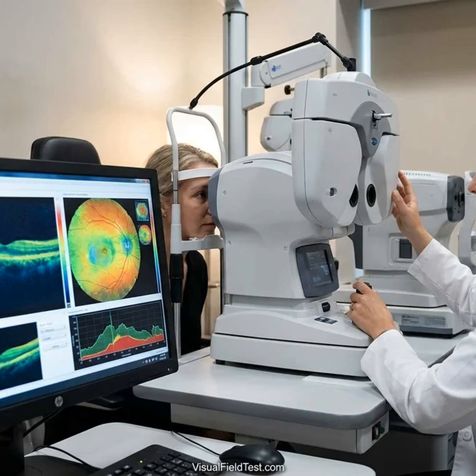In practice, the scan schedule is personalized. Many clinics bundle OCTs with regular visits so that patients get an OCT at each checkup. The key is consistency. Doctors prefer to compare scans done on the same machine under similar conditions.